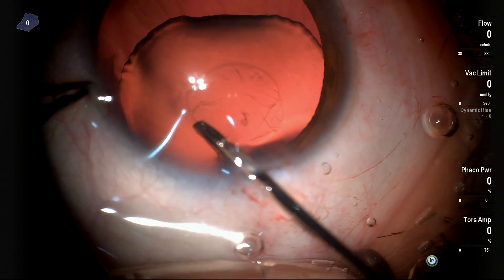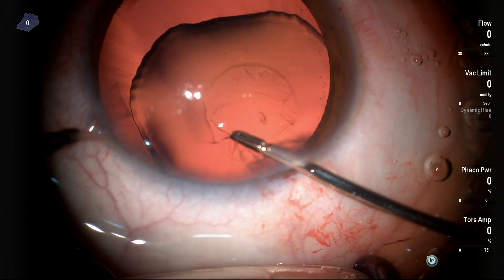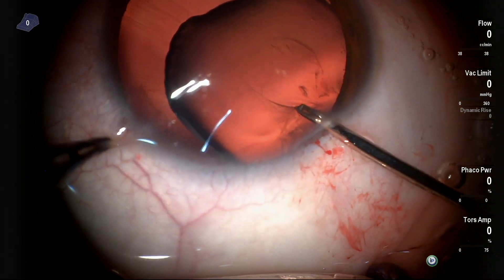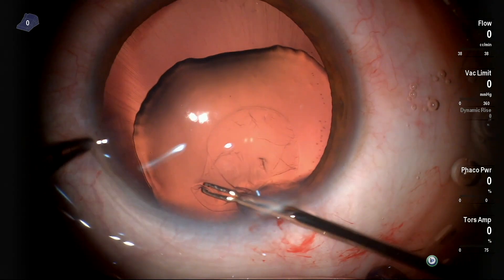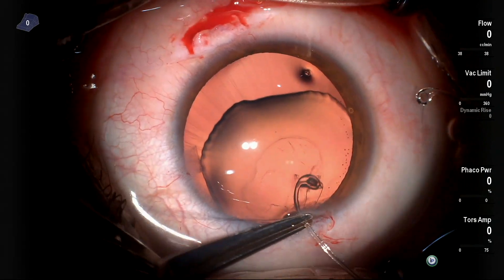As you can see here, the capsular rhexis was about to extend. By adopting the Litle's technique and pulling the capsular rhexis edge towards the center or even backwards, this helped in retaining the rhexis and completing it.